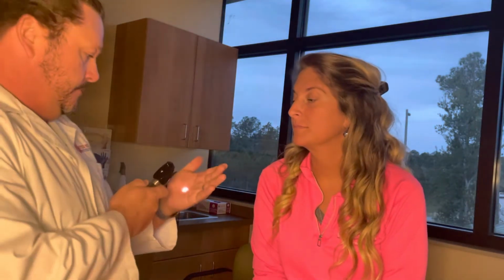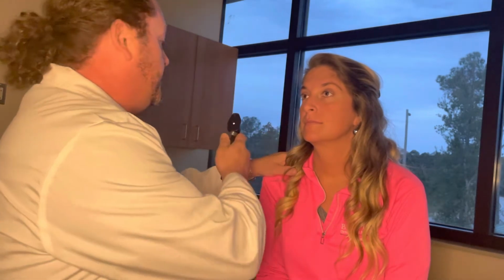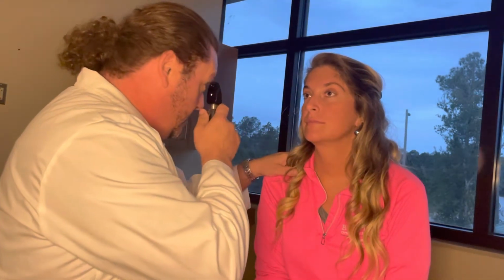Okay, next we're going to go ahead and dim the lights in here. Just want to let you know, I'm going to be getting up close into your face. We're going to take a look at the back of your eye, okay? So again, we'll dim the light in the room, get my ophthalmoscope on. I'm going to place my hand over here on her shoulder just to give me a reference point. I also have my pinky out here in case I get too close. I'm not going to end up poking her.